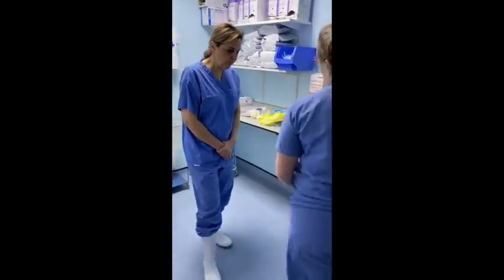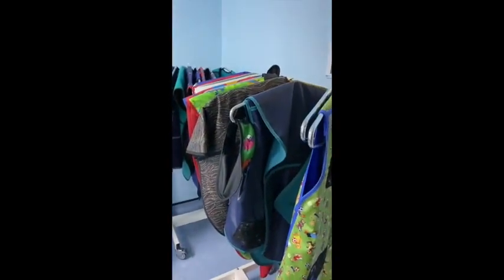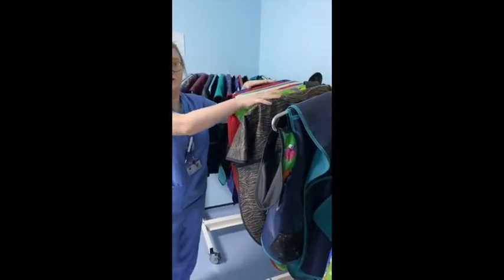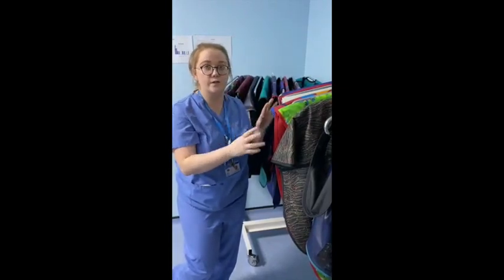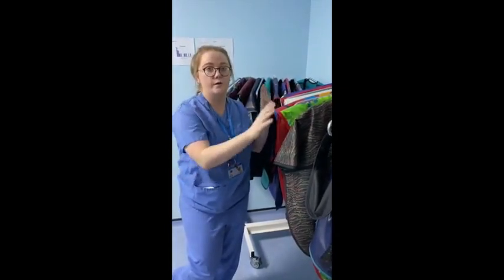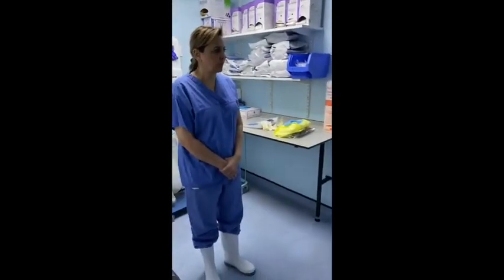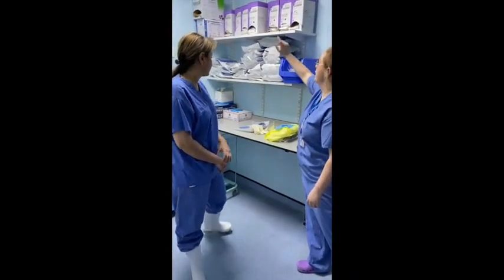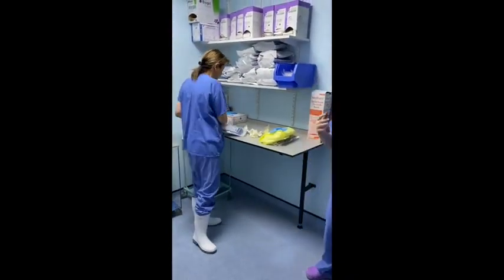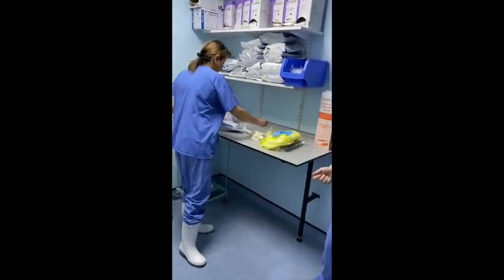Then out here, we will have lead and all of the equipment we need to wear to protect ourselves. This lead is going to be classed as a dirty lead. We will not be bringing any form of lead in with us. That includes thyroid shields. There will be thyroid shields, lead skirts and tops provided in this lab. So the next step, once we come in and have positioned our equipment down, as operators, you will have to get a sterile gown and sterile gloves. Anyone who is not an operator will just need to grab one of these gowns and open the pack for themselves.